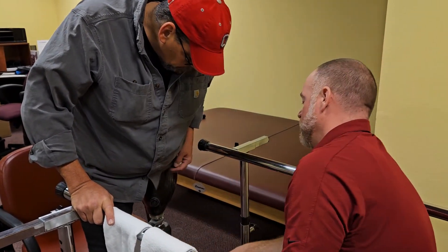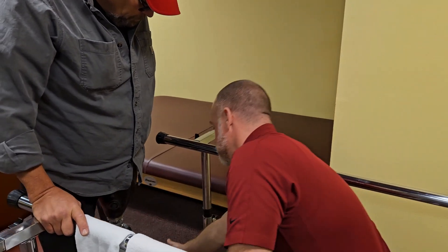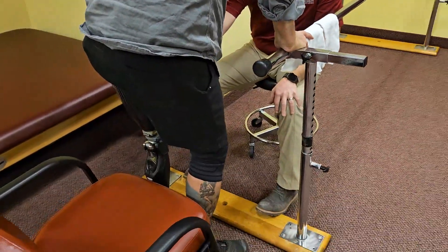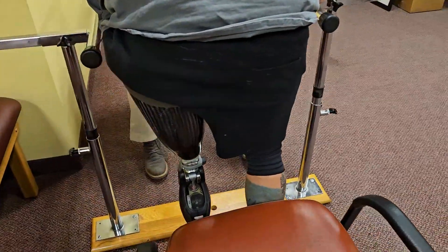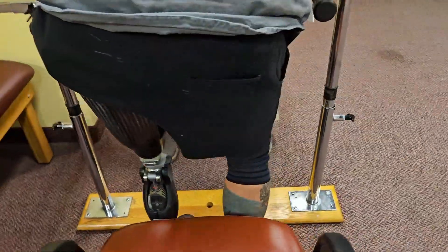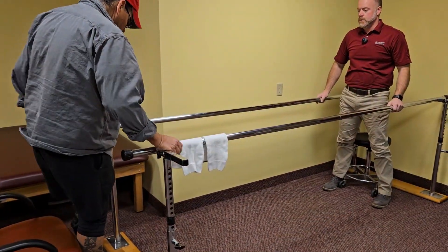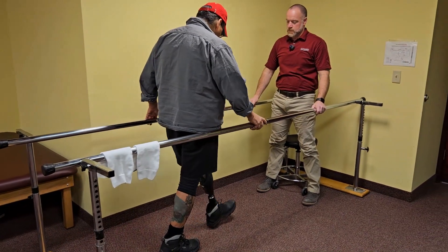From this point, lift the prosthesis completely off the ground and gently push down on it. If you feel like you want to get more air out as you have your weight on the prosthesis, just push that button and let more air out. Once it feels like all the air is out, keep both hands on the bars.